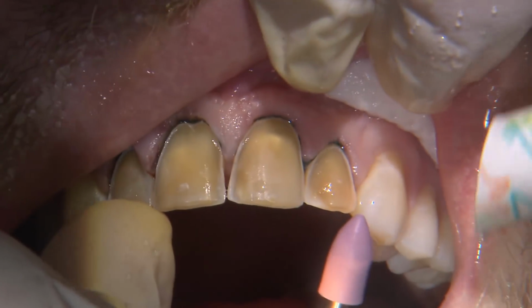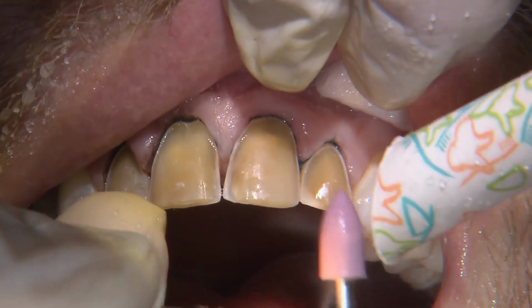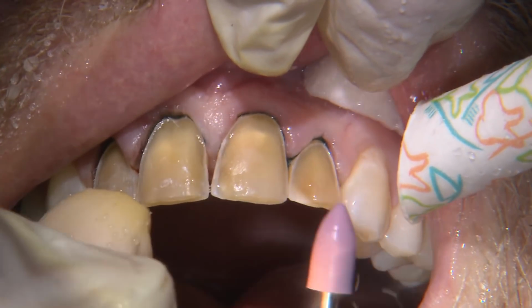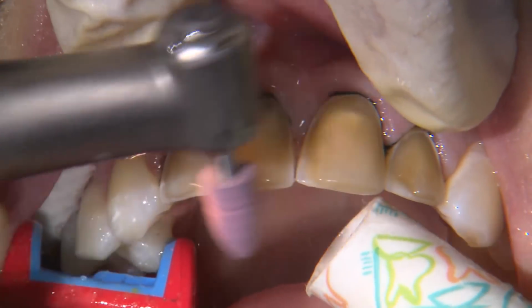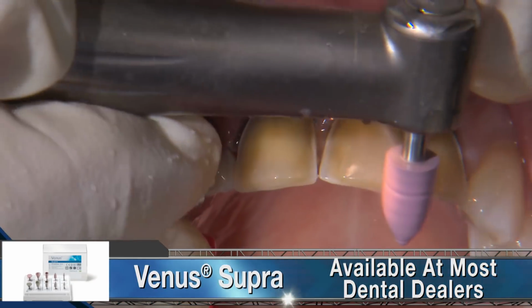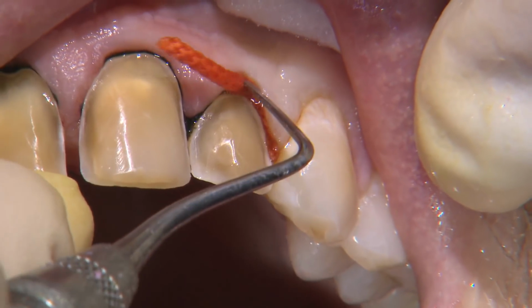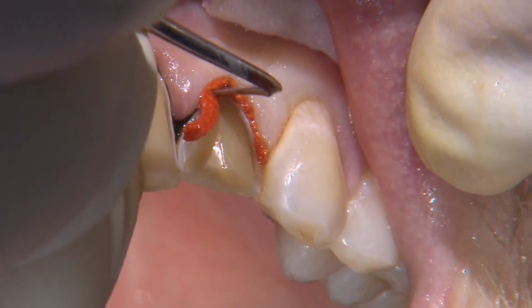As with any all-ceramic preparation, we want to round off any internal line angles for ease of fabrication and to ensure the final restorations are well adapted to the teeth with minimal internal stress. With these veneer preps, the main sharp internal line angle is found at the labial incisal interface. So here I'm using a Venus Supra coarse composite polisher at about 10,000 RPM to round over this transition. To have a smooth path of insertion for the veneers from the facial direction, I angle the incisal parts of the prep cervically from lingual to facial.